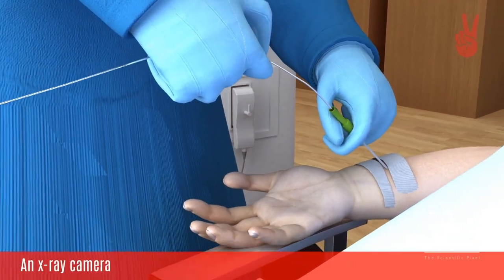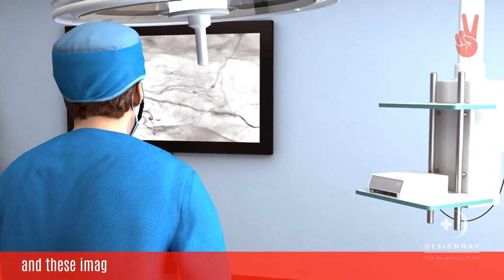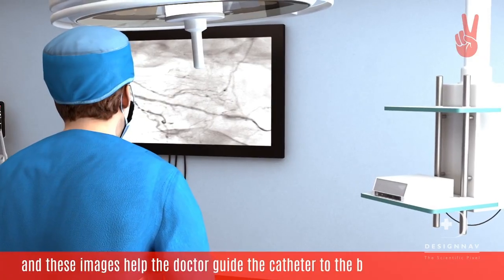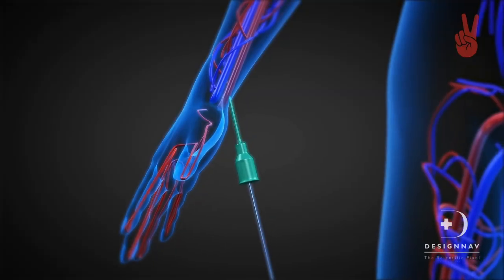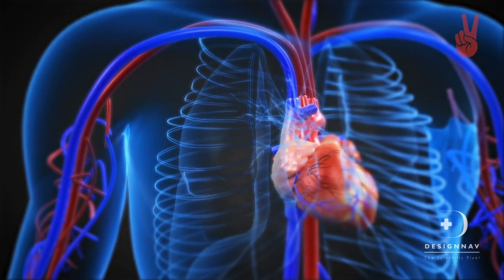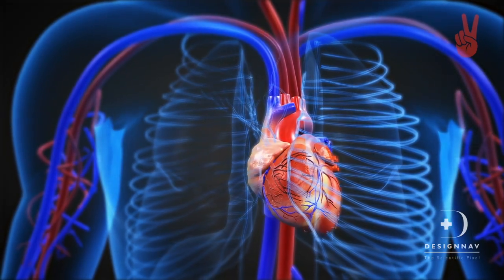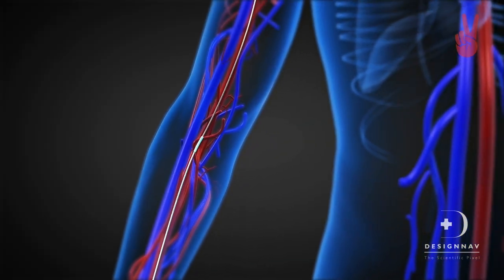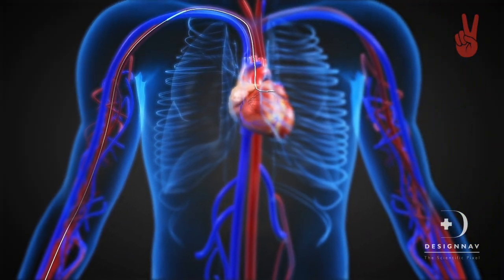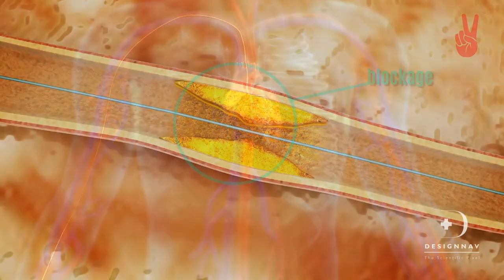An X-ray camera is used to project images of your arteries onto a television screen, and these images help the doctor guide the catheter to the blockage in the artery. A tiny thin wire is then passed across the narrowed segment. It serves as a support for positioning the tiny balloon across the blockage. Next, a long, thin, flexible tube with a small uninflated balloon at its tip is threaded through the guiding catheter over the guide wire and into the artery to where the artery is blocked.